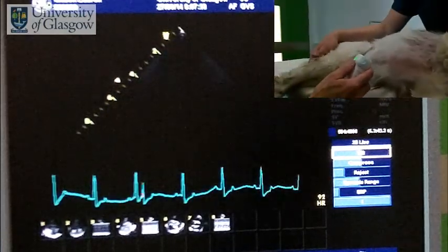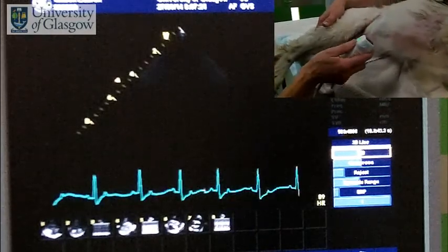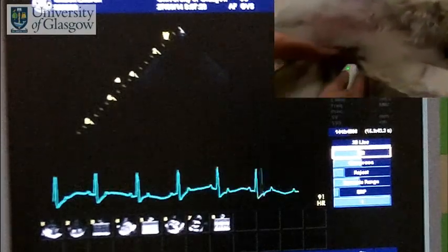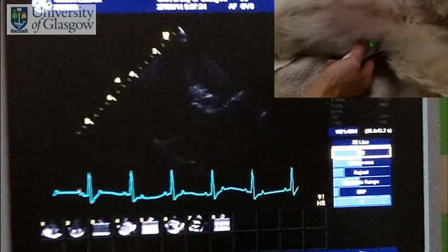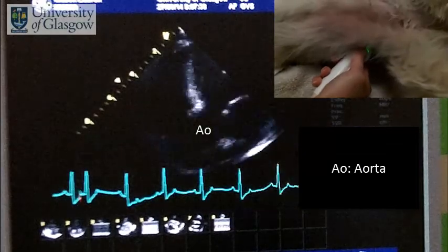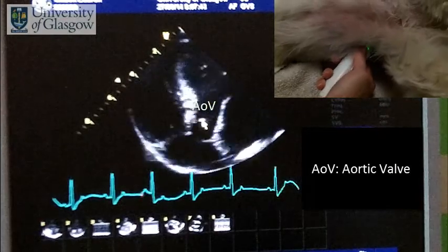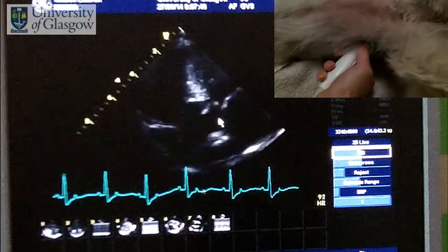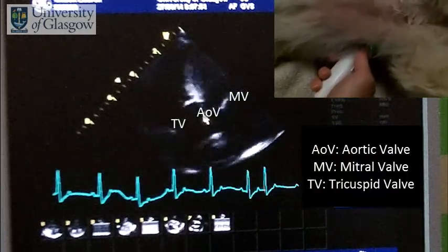The next thing we're going to look at is the aorta. To see the aorta we need to go back to the apex and then angle cranially to try and follow the aorta, so back onto the apical beat and then on this occasion angle cranially — and that gives us the best image of the aorta. This is the aortic valve here, and we can look at the morphology of the valve itself and see that it looks normal. The mitral valve is over here, tricuspid valve over here, aortic valve here.